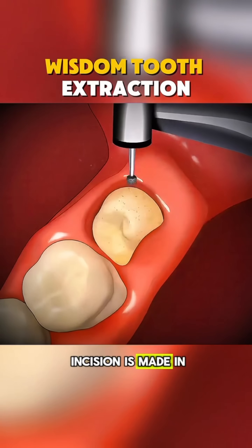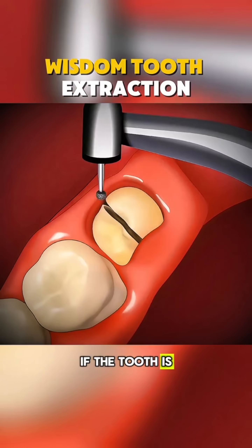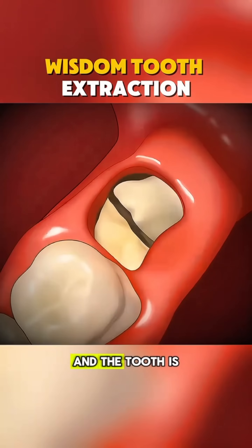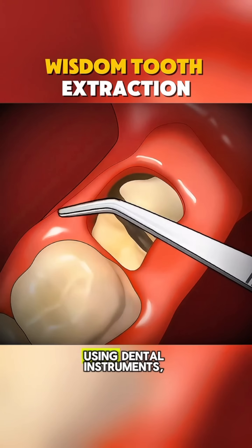Once numb, a small incision is made in the gum tissue to expose the tooth and bone. If the tooth is impacted, bone blocking access to the tooth root may be removed, and the tooth is often sectioned into smaller pieces for easier removal.